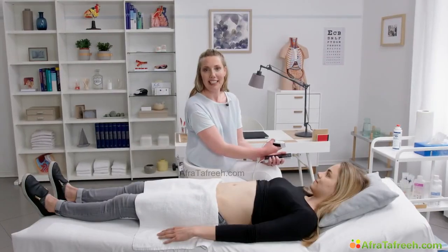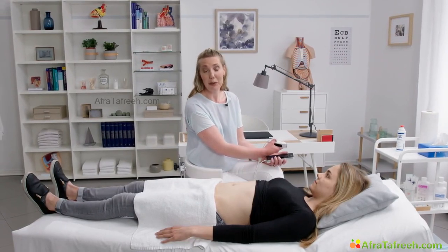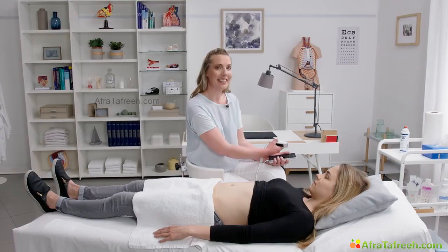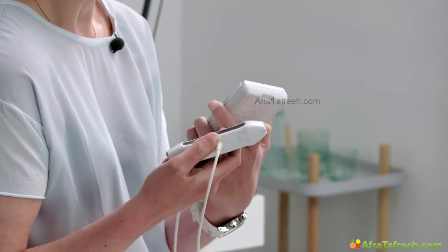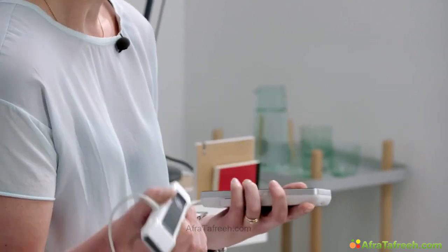I'm really enthusiastic that I can finally take you to the live scanning part. I'd like to show you everything I told you before in my lecture. This is going to be the fun part. For the live scanning, I'm using a handheld device. This device has a probe which you can use on both sides. This one is the linear side, and this one is the sector side. As I want to approach the uterus via the abdomen, I use today the sector side.